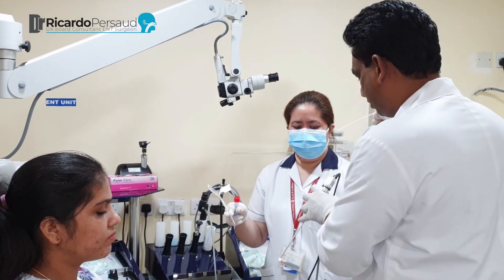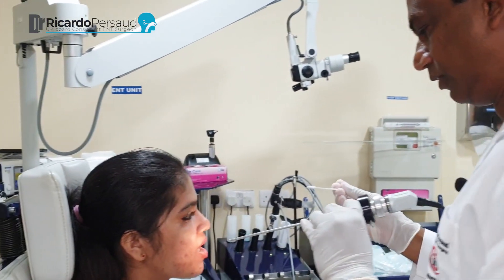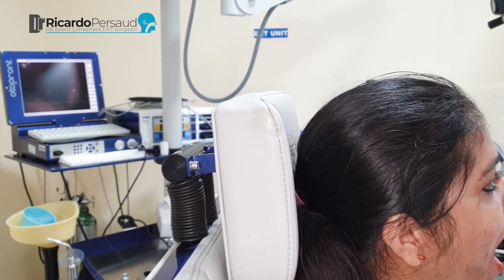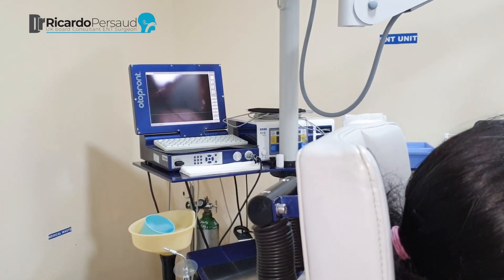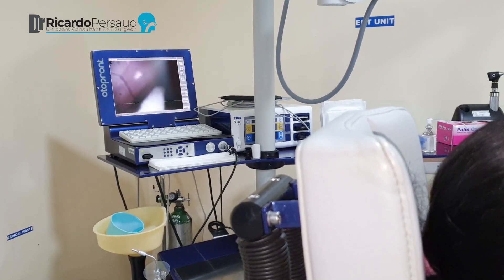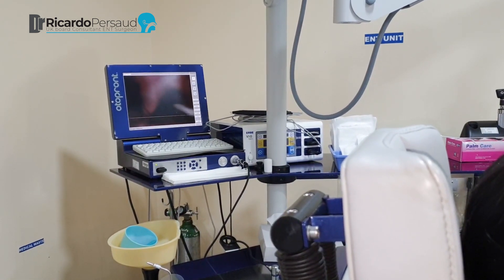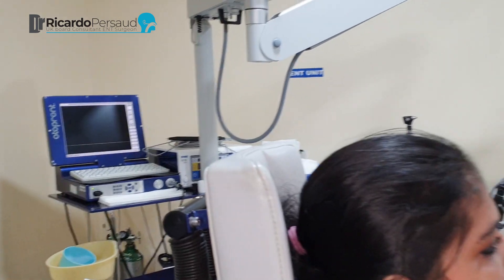So I'm going to demonstrate where exactly in the mouth you take the swab. We've got the uvula there and if we go to the tonsils — we want the tonsil area. So we brush the tonsil like that. We can even brush the other side as well. And there's no gagging — you'll notice that if you go to the back wall, the patient will gag. So we've taken a sample from the throat.